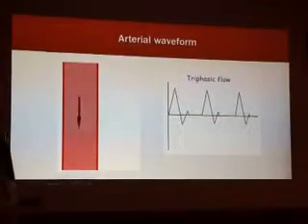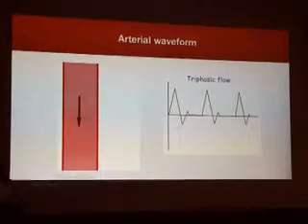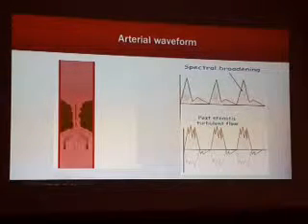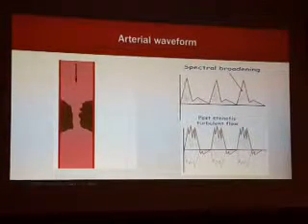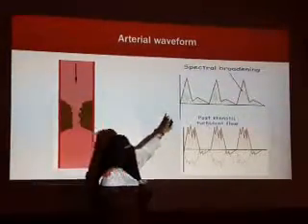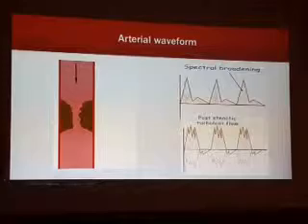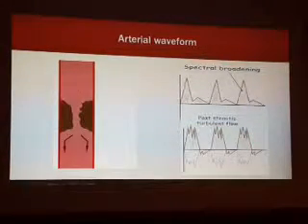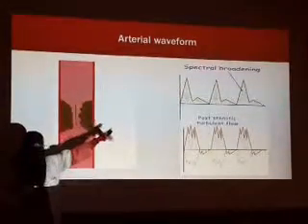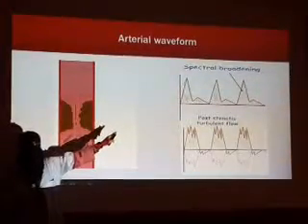Now let's see. Now the blood is passing normally, nothing obstructing it. I will get normal waveform اللي هي triphasic. Once I have stenosis, narrowing, occlusion, the waveform will be different. Now in here I will see high sharp peak. stenosis لأنه حيوصل عالي، حيوصل 200, 300, 400، وما حيكون anymore triphasic، حيكون على طول biphasic. فأنا عندي هنا stenotic area. It's combined with the appearance of a waveform. So I am correct. في هنا stenosis وأعطاني abnormal waveform.